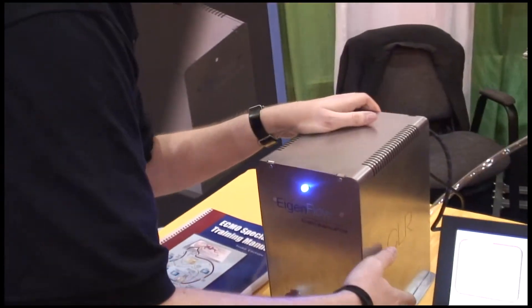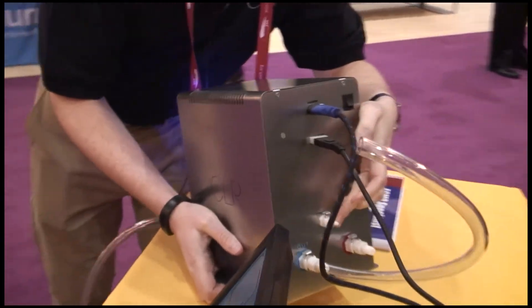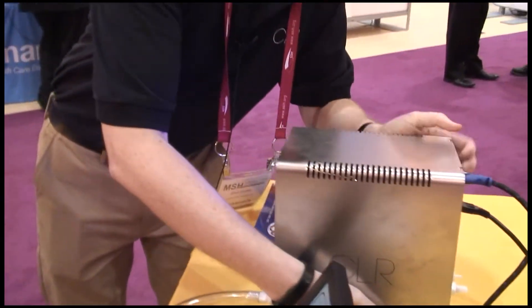On the back there's also an air port for putting air into the system as well. Another problem is getting air embolisms into the system and trying to filter those out, so we've incorporated that as well.